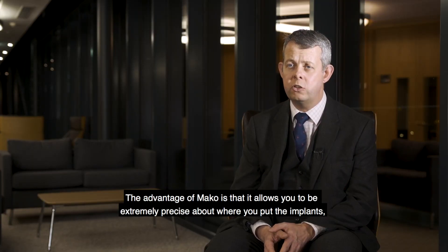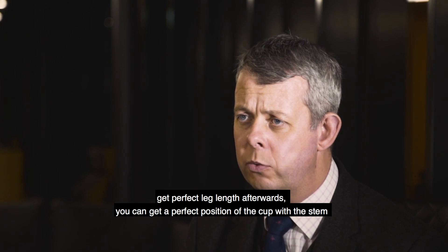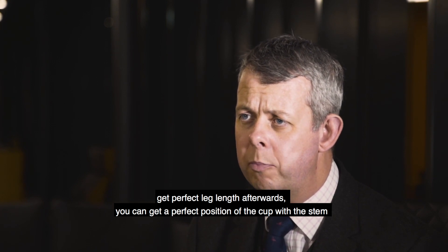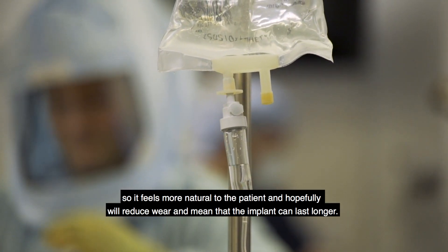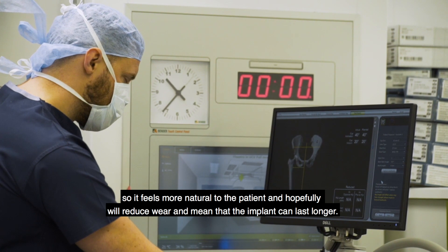The advantage of Mako is it allows you to be extremely precise about where you put the implants. You can get perfect leg length, perfect position of the cup or the stem, so it feels more natural to the patient and hopefully will reduce wear and mean that the implant can last longer.